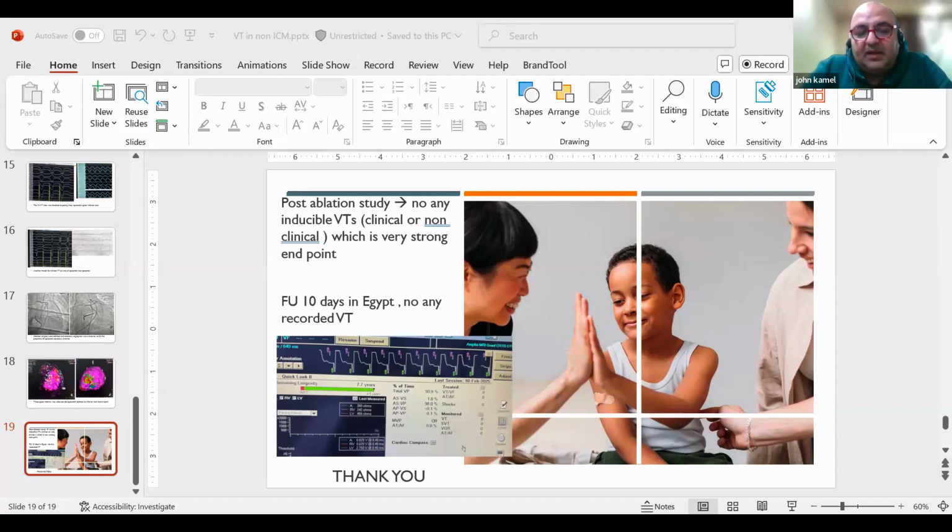and give heparin. But in general, in my cases, if I did an endocardial ablation and even gave 10,000 of heparin and did a map for 2 or 3 hours, I am comfortable to do an epicardial access without reversion of heparin.